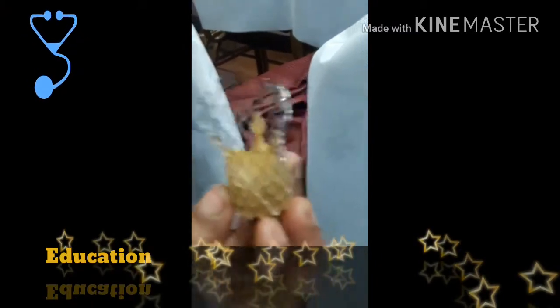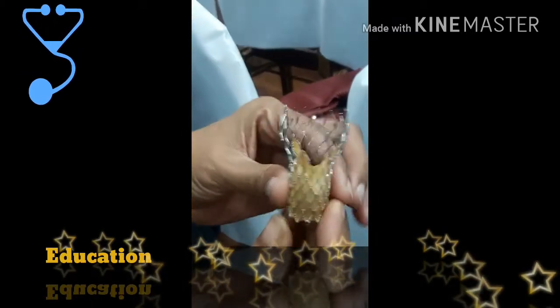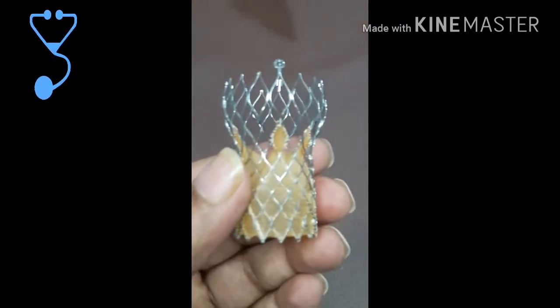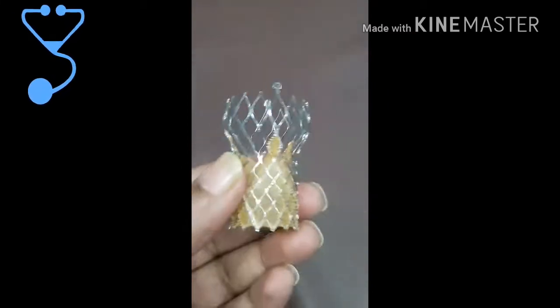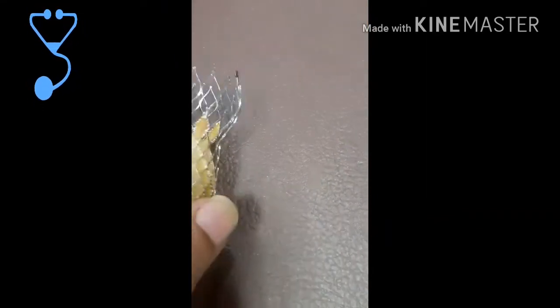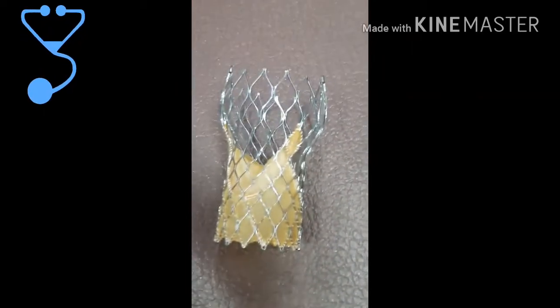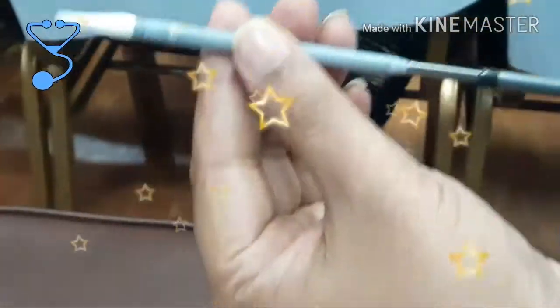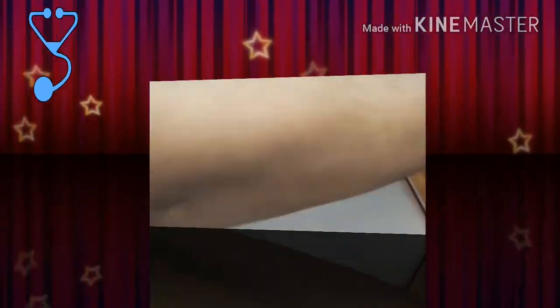We call it TAVR. TAVR is basically a way of getting a new valve inside of you without making a real incision. What it means essentially is the valve itself is loaded within a stent, and that stent is then inserted into your body. Most commonly, that's inserted through one of the arteries in the leg. That valve then works its way up the artery, it's loaded on a wire, and basically is positioned where your current diseased aortic valve is, and the valve is just blown up. When the valve is blown up or inflated, it pushes your old valve out of the way, and now you have a new functioning valve in place of where the other one used to be.